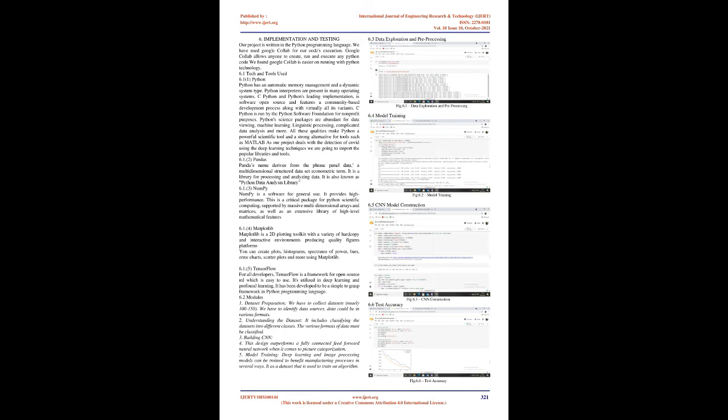Pooling is done by 2*2 max pooling layers, which come after some of the CONV layers. ReLU is applied after the fully connected layer and the dropout layer. As a result, the model has been trained, and the X-ray has been categorized as normal or COVID.